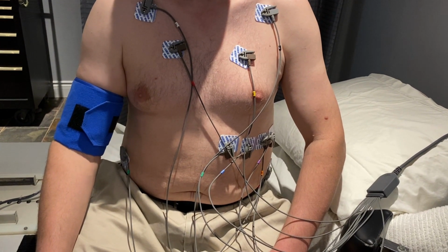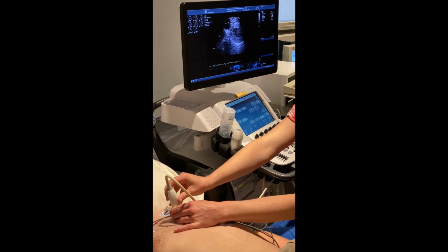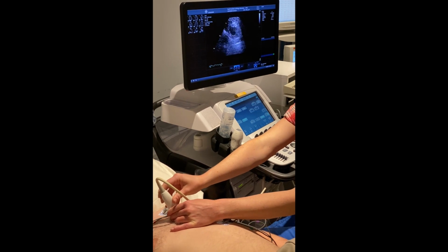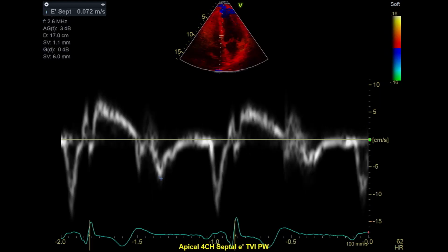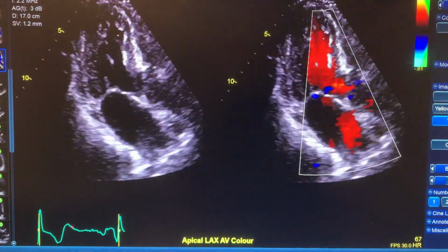Resting ultrasound or echo pictures will be taken with a transducer and gel between your ribs. On rare occasions, this might provoke a little discomfort if the rib spaces are small and tender. Generally, though, this is a painless test. While you're being scanned, do not talk, as this can worsen image quality.